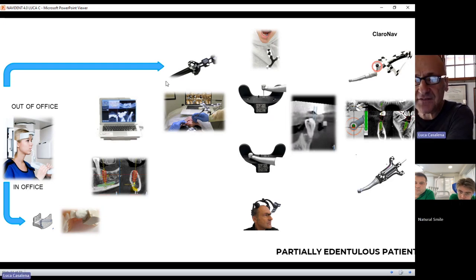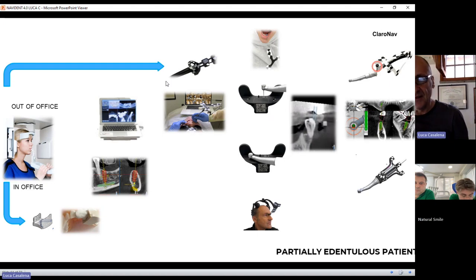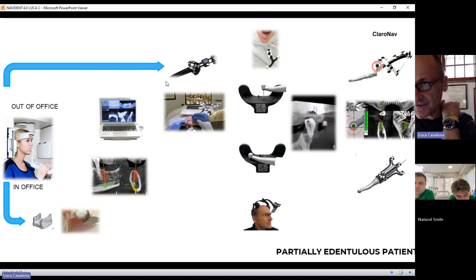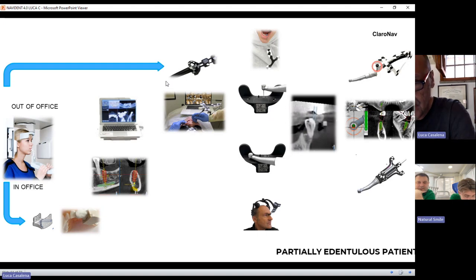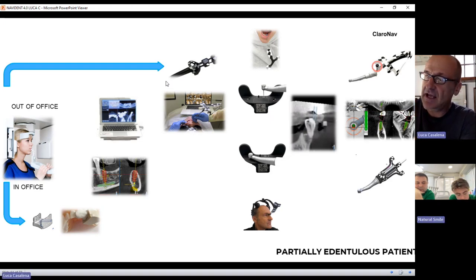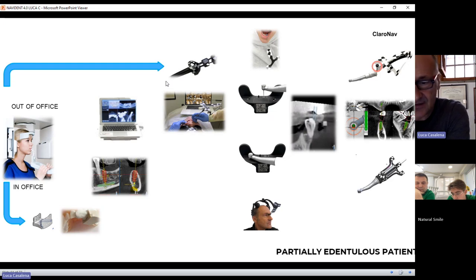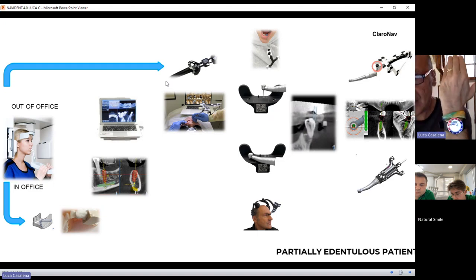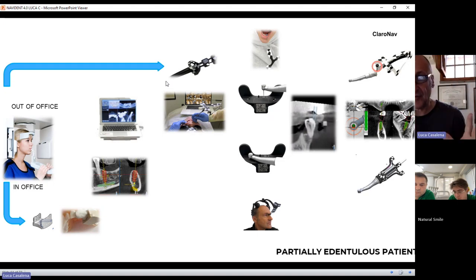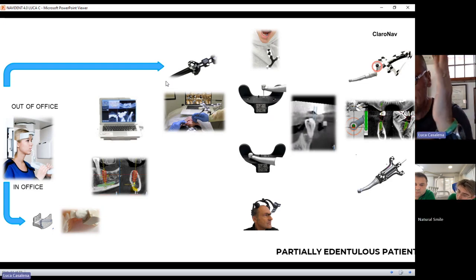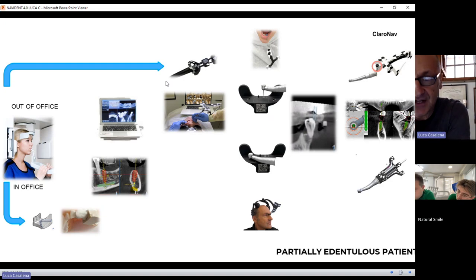Secondly, you touch with the tip of the tracer the trigger point you identified on the panoramic — on the 3D rendering of the patient. You stay put for one second on that trigger point, and the trigger point should be a cusp. Why a cusp? Because a cusp is a zenith — a point. You can easily find one point on the top of a curve. If you take a point on a flat surface, it's more challenging to identify precisely. You always want a cusp as a trigger point because the cusp is easily touched by your tracer.